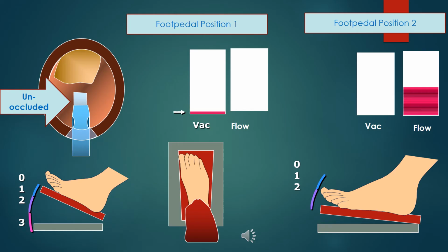So to aspirate the cataract from the eye, you need 4 things, what we know as Phaco fluidics. You need irrigation, you need aspiration, you need the buildup of vacuum, whether it's a Venturi pump or a peristaltic pump, you need vacuum. The only difference is how it builds vacuum. It is different between the two pumps.